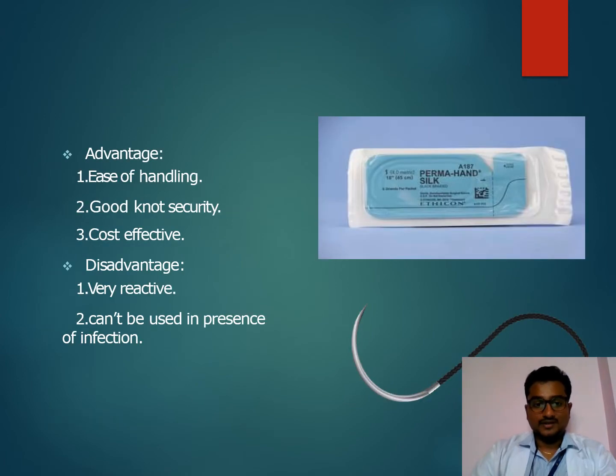Advantages of silk suturing are ease of handling, good knot security, and cost effectiveness. Disadvantages are that it is very reactive and can't be used in the presence of infection.